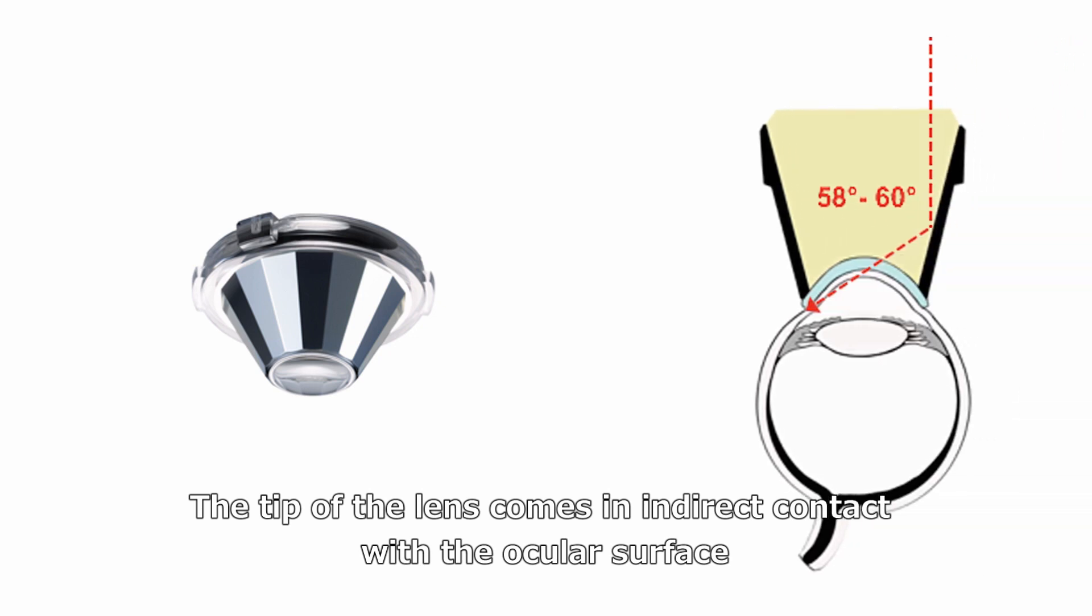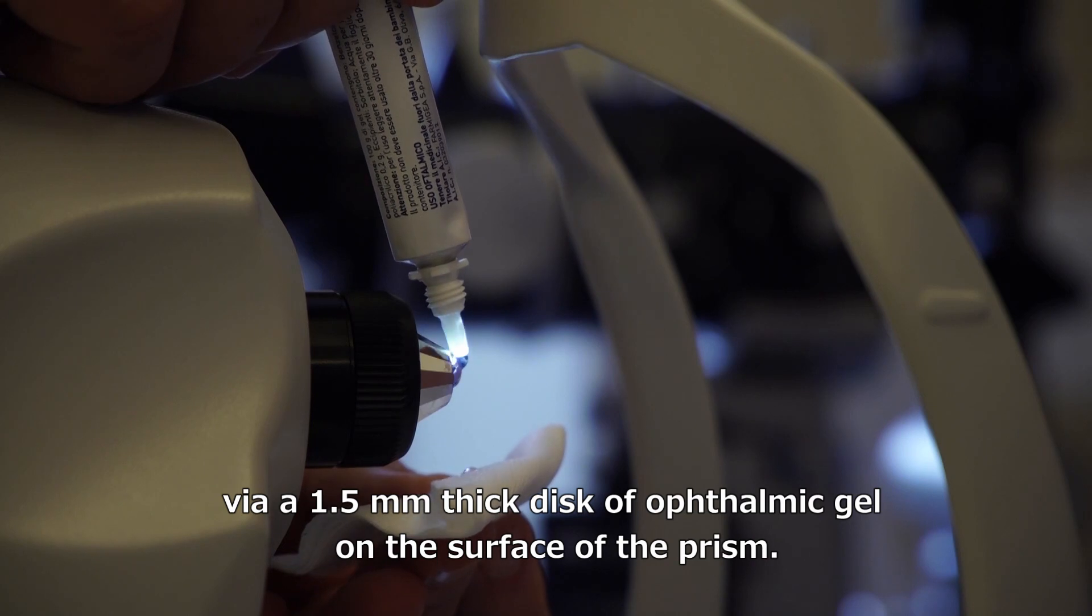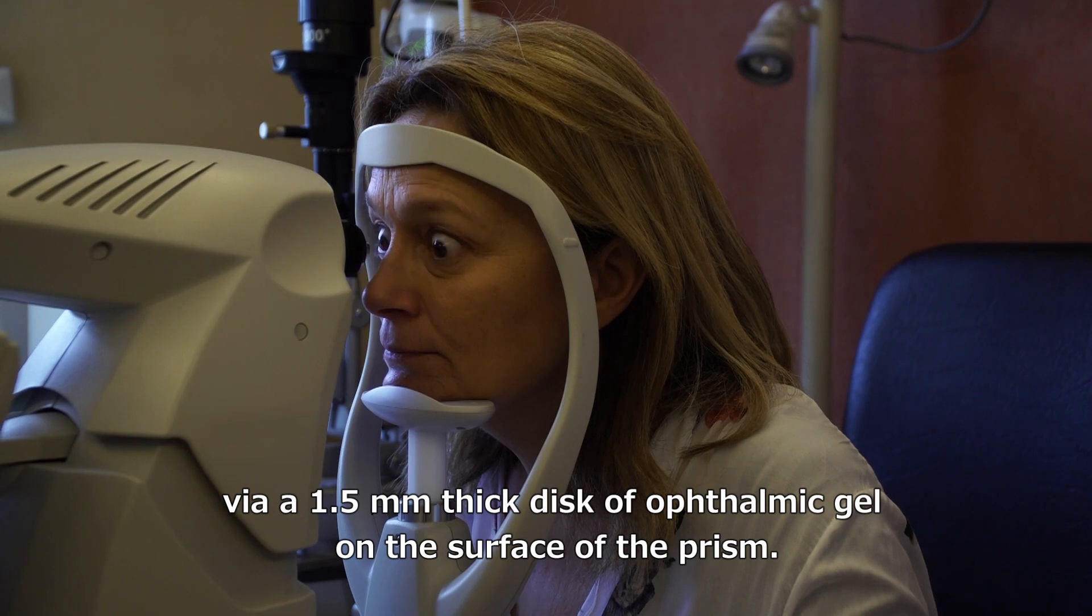The tip of the lens comes in indirect contact with the ocular surface via a 1.5 mm thick disc of ophthalmic gel on the surface of the prism.